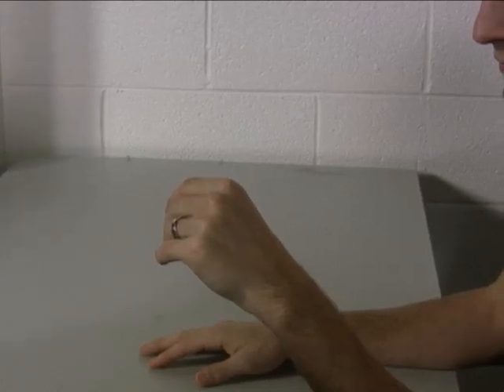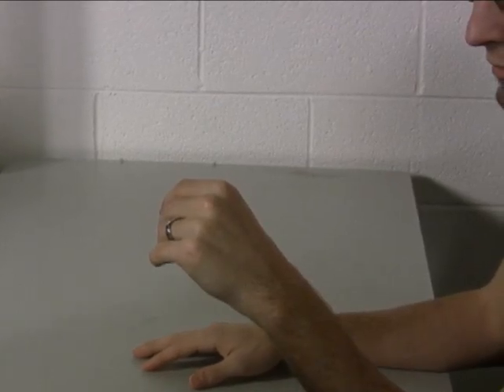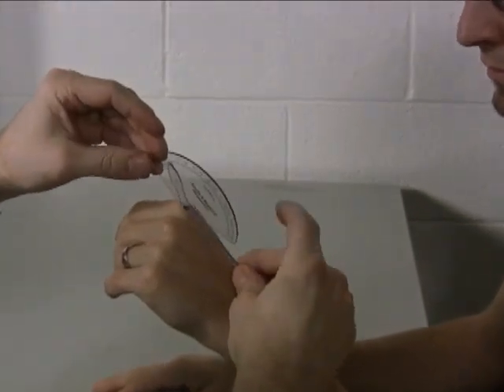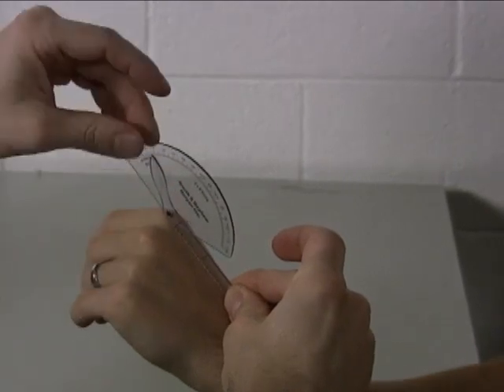To measure finger metacarpophalangeal joint range of motion, you're going to place the goniometer actually on its edge on the back of the hand.